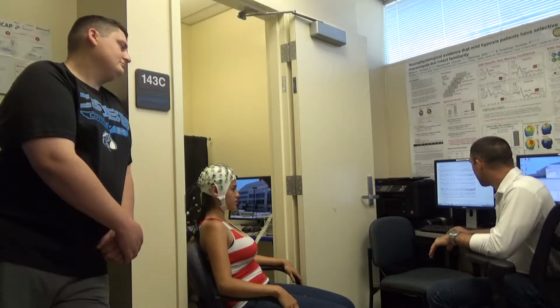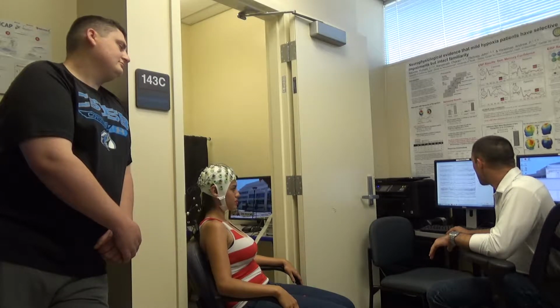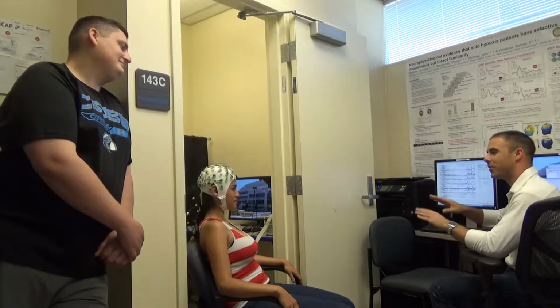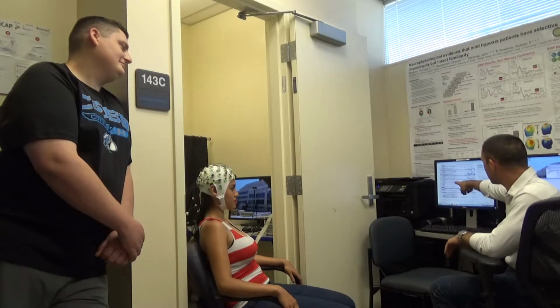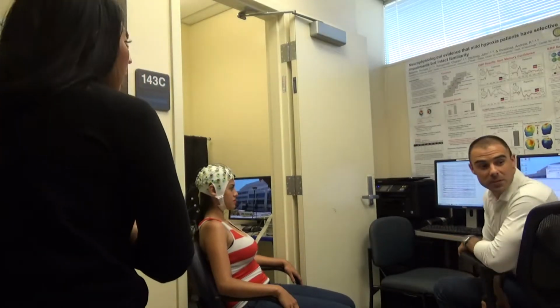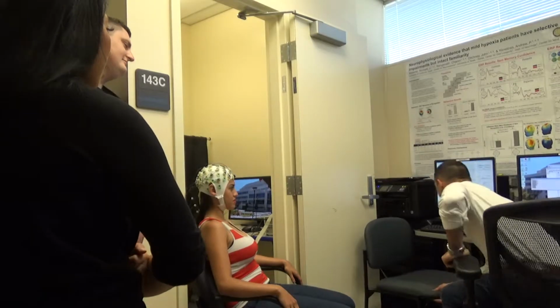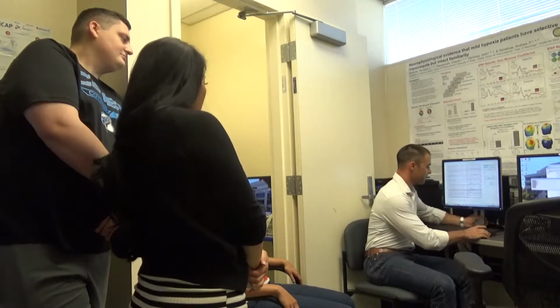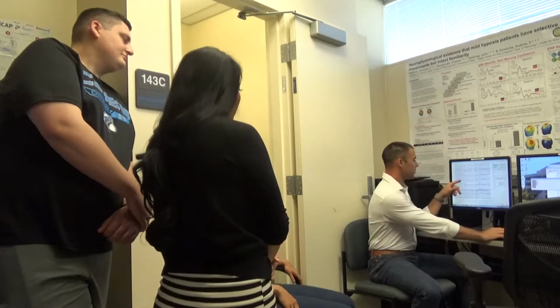Now, let's say that we want to see the EEG of the cha-cha that you requested a moment ago. Let's say your participant decides to get some happy feet in her boredom of taking the experiment, and you start tapping your feet along. Look at what's happening in the EEG now. Does this look familiar to any of you during your artifact cleaning of the experiment? It was really thick, like the lines were really dark. Yeah, so, okay, stop.